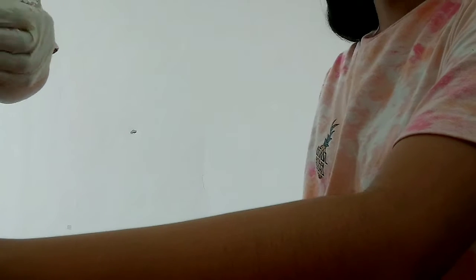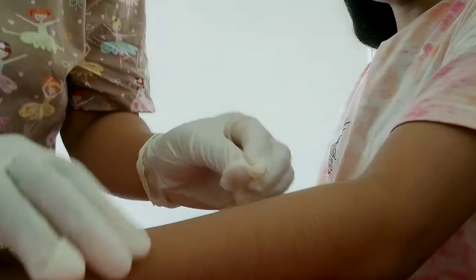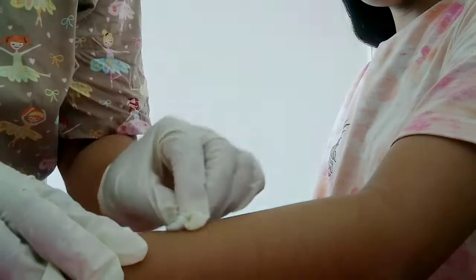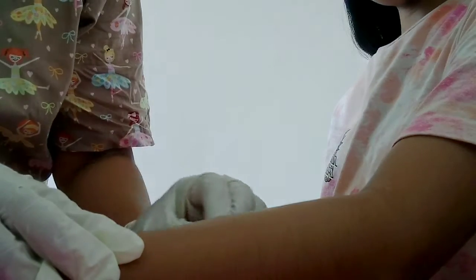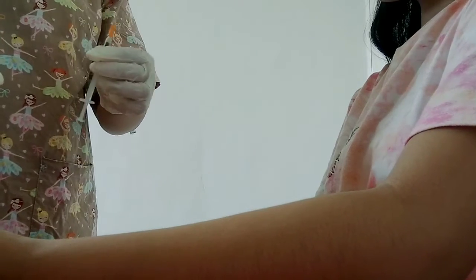Now, use an antiseptic swab or cotton ball to clean the site, beginning at the center in a circular motion going outward. Then we are going to remove the cap and hold the syringe using the forefinger and thumb, with the bevel of the needle pointing up.